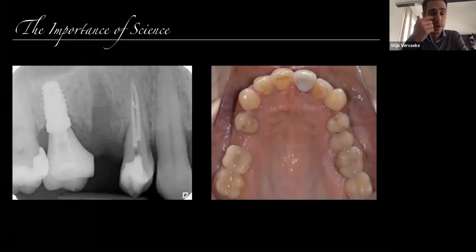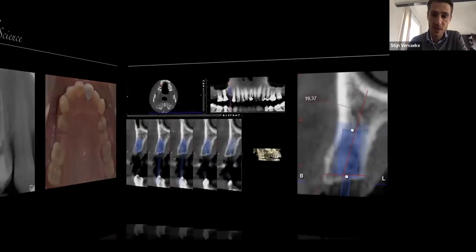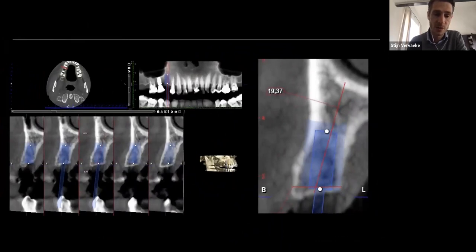So then we come to our responsibility as a surgeon, as a prosthodontist. Let me share with you a case of one of our students at Ghent University, a case that was treated with a supervisor that is not working with AstraTech in his private practice. And of course, you have to be careful when EV implants are installed, because it's a cylindrical implant. It's also a cylindrical implant with rather blunt threads.